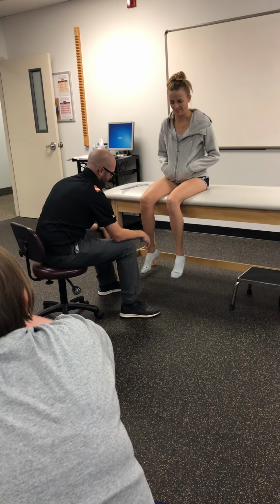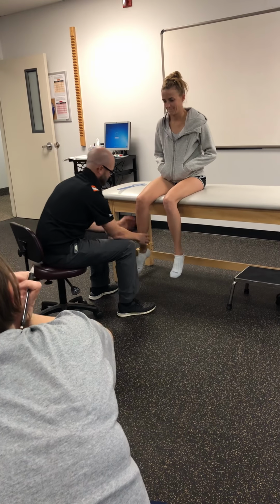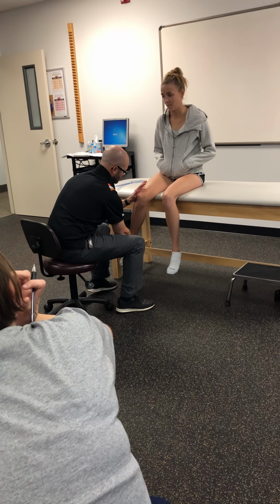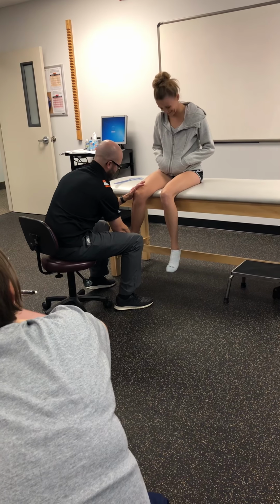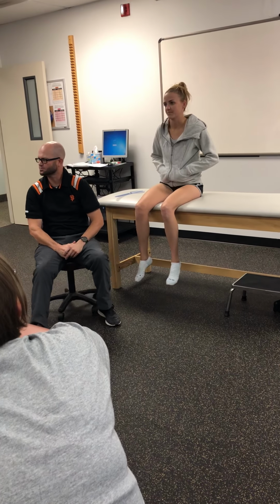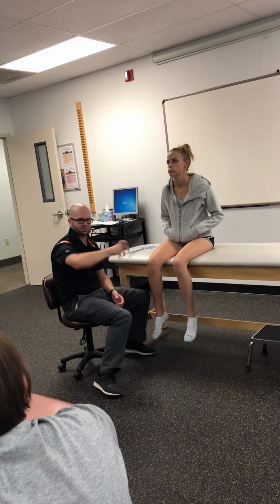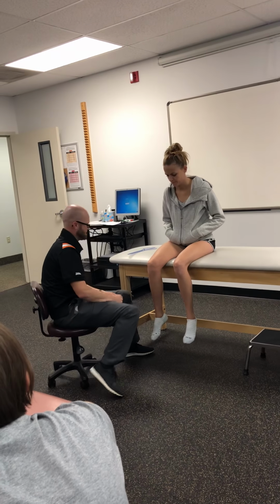Well, first, actively, let's do internal rotation. I just want you to lift your leg up. There we go. Good. And now I'm going to take her passively. That's about as far as she gets. Okay. What kind of end feel would be considered normal with internal and external rotation? Okay, soft tissue stretch, also known as firm. If we want to get really specific, capsular, because it's the capsule that's typically tight or that's stopping that motion.